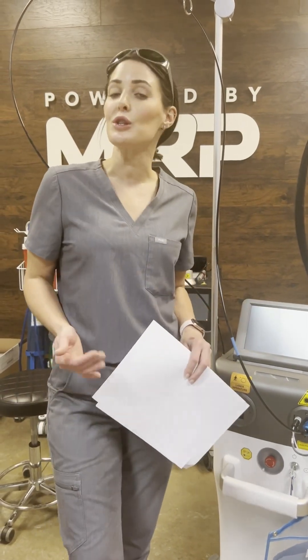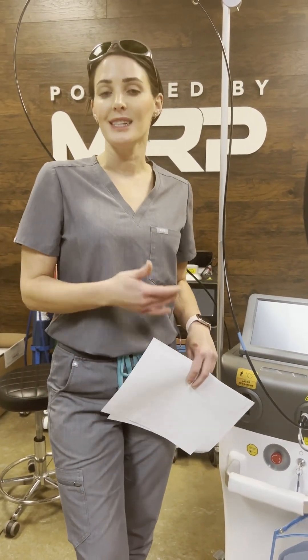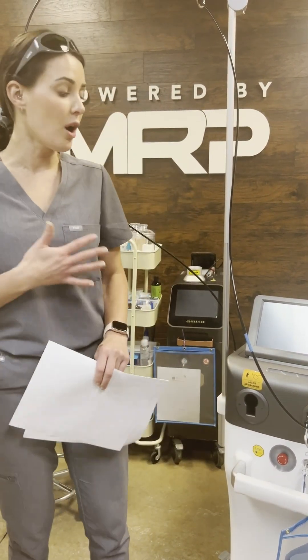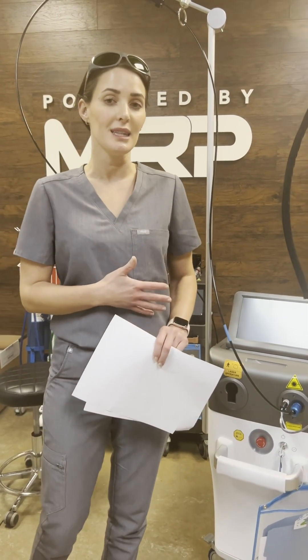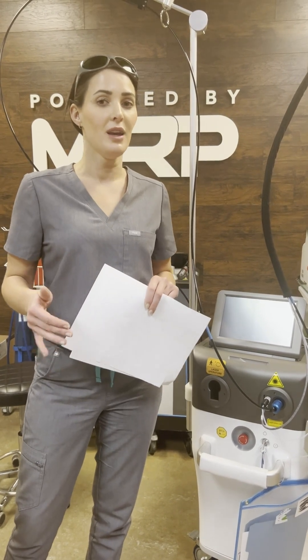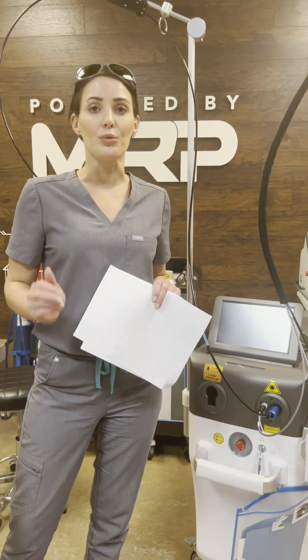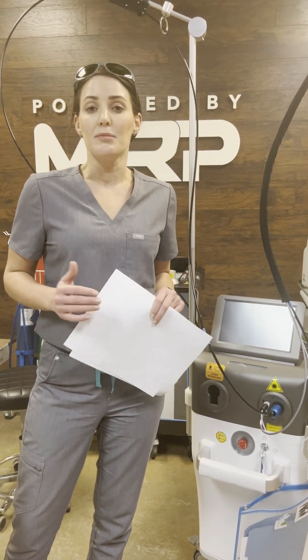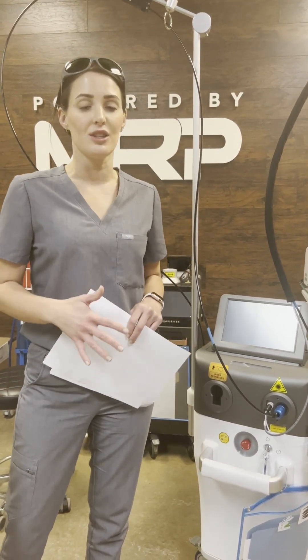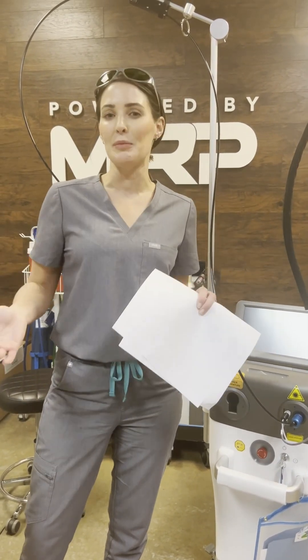At the end, the client was super happy and did wonderful with no discomfort. You got to see how the handpiece works for the 1064/755 in hair removal, and you also got to see the fractional handpiece for brightening, tightening, toning, resurfacing, and even for melasma. This device does a lot — it also has great information on treatment settings, outcomes, post-care, and pre-care. All of this is included with this device. If you have any questions, let us know. I'm Chesney and I hope you enjoyed this.